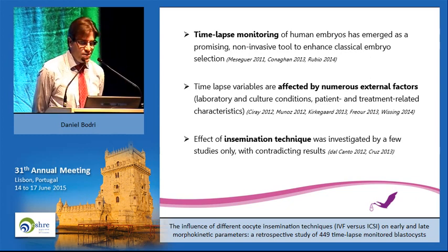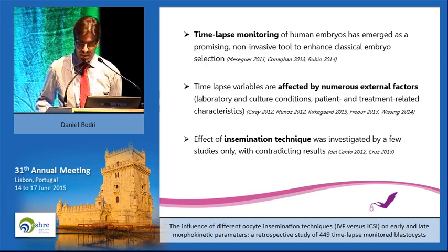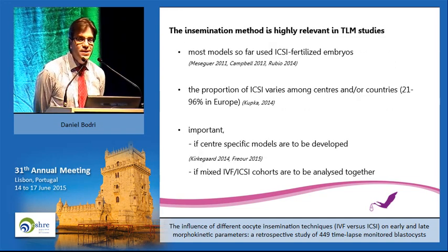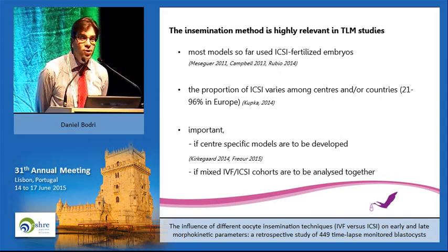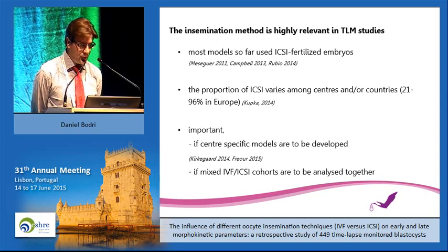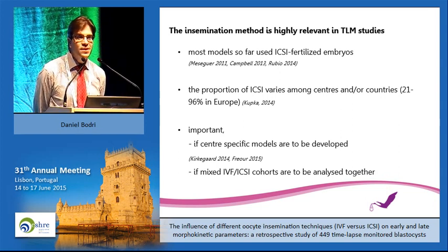Among these factors, the influence of different oocyte insemination techniques has only been investigated by a handful of studies so far, yielding somewhat contradicting results. The insemination method used has a considerable impact on time-lapse variables. In fact, most predictive models so far included ICSI-fertilized embryos only, whereas the proportion of ICSI cycles is largely variable between centers and countries. This is of importance because each IVF unit has been encouraged to develop its own predictive model, since it has been shown that models developed elsewhere cannot be adopted.